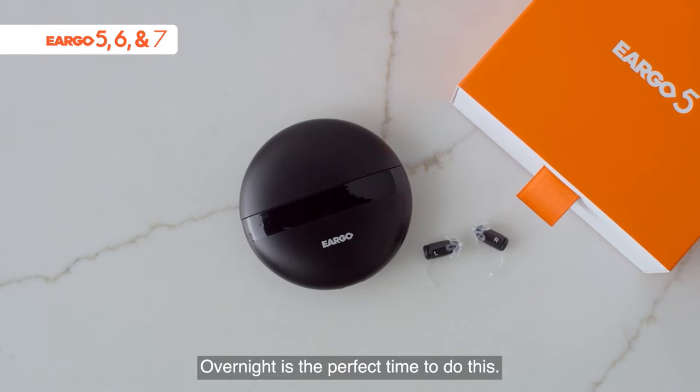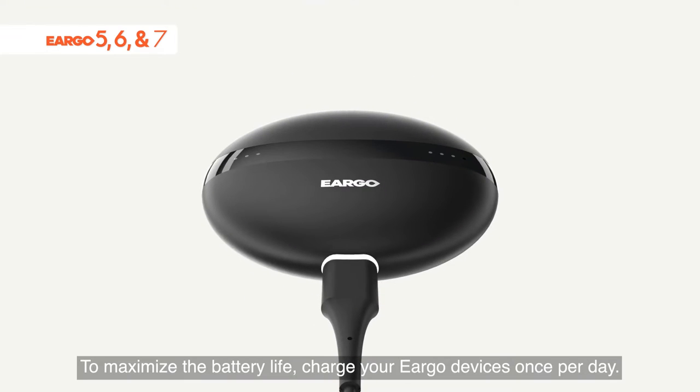Overnight is the perfect time to do this. To maximize the battery life, charge your Eargo devices once per day.